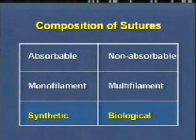Synthetic absorbable suture materials, which closely resemble naturally occurring body substances, can be produced chemically. These can be absorbed without the tissue reactions often associated with natural fibres. The advantage of synthetic absorbable sutures is that they have very predictable strength retention and absorption profiles. In addition, they tend to be very strong materials which virtually eliminate the risk of adverse reactions.